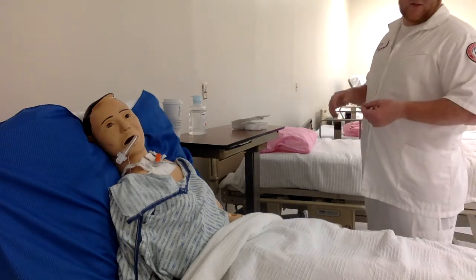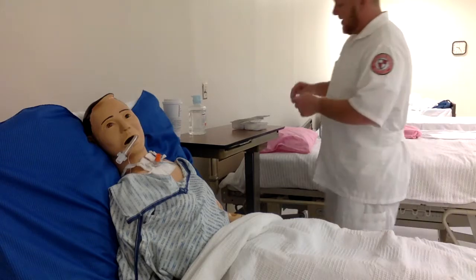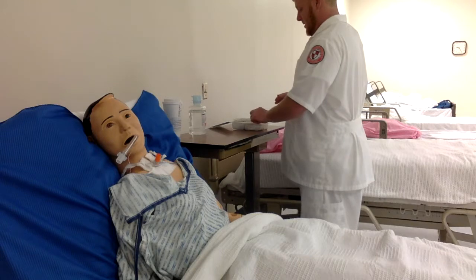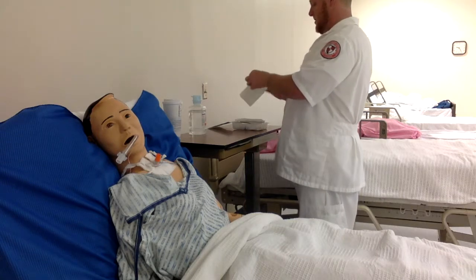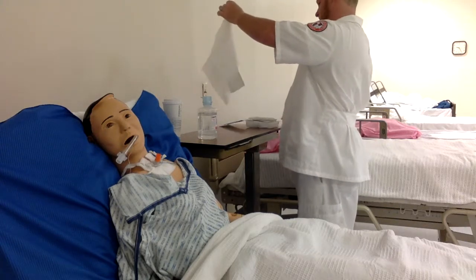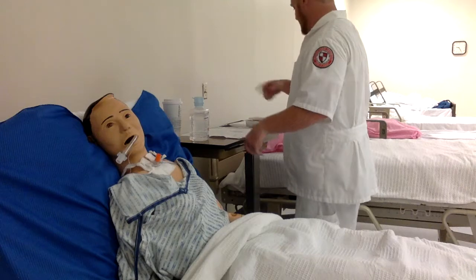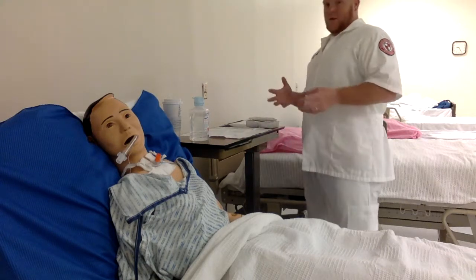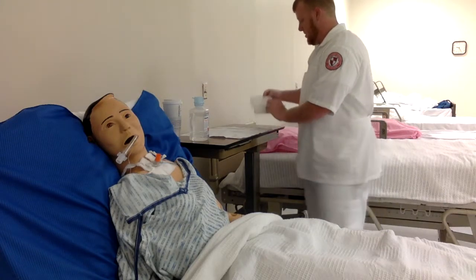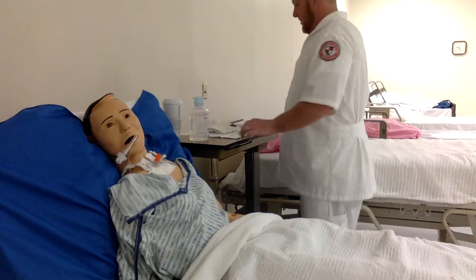Next, I'm going to take my catheter and open up the kit. You're going to open the kit up. This is the sterile field — make sure you open it up away from you and set it down. You can touch the outside edges but you do not want to touch the center because it would be contaminated. Keep all the contents inside.